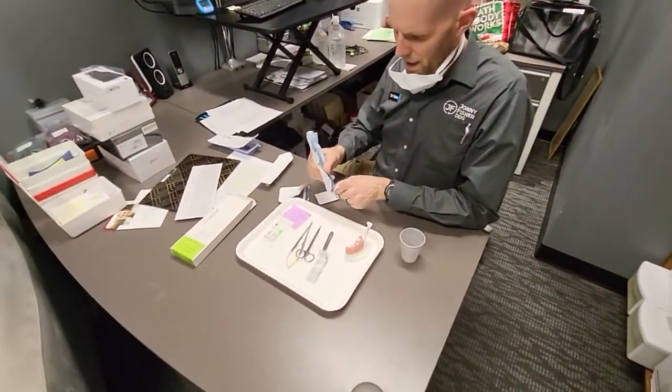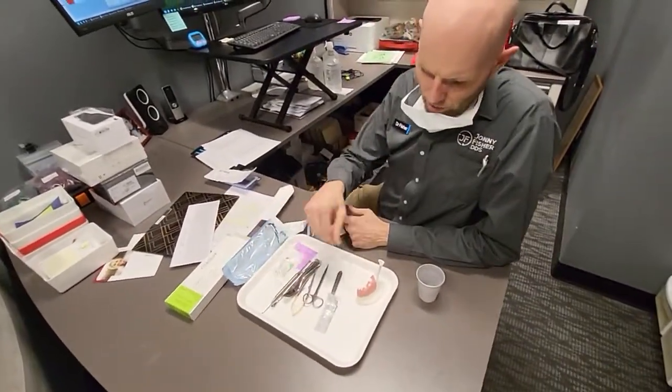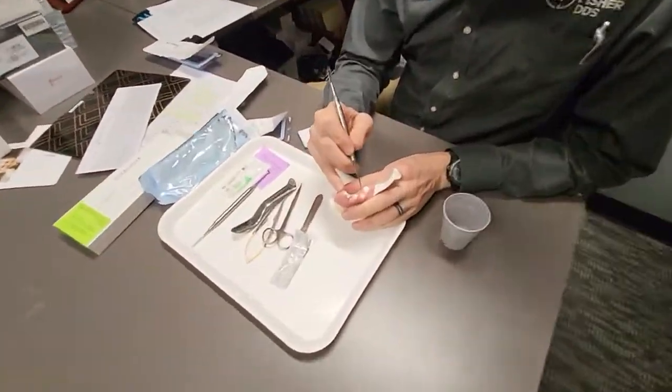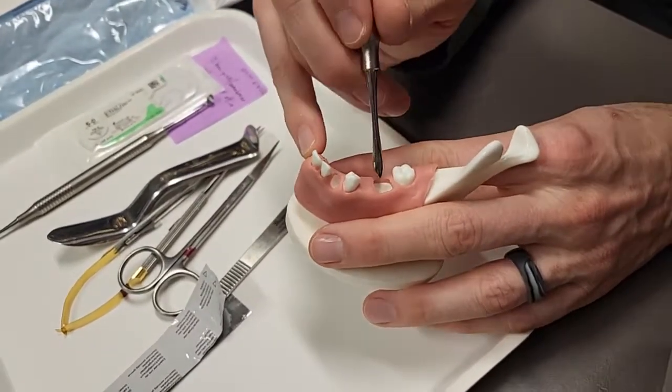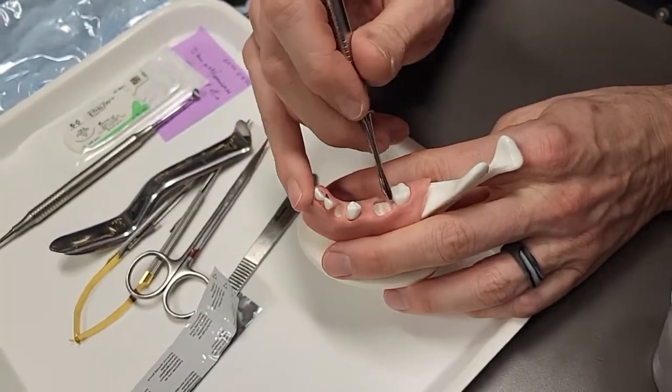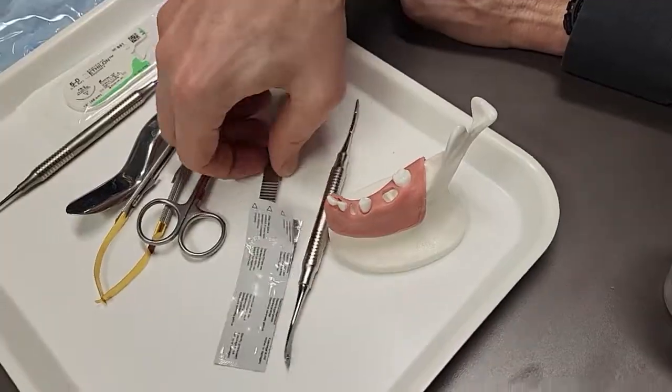So we've got — it doesn't take that many tools once you've gotten the tooth out. In this case, you can zoom in here — basically got our missing tooth here, number 19, that's Audi's priority. We took it out nice and clean. We didn't have to do any kind of flap procedure, but I'll show you what kind of flap procedure I would use anyway when it's time for that.